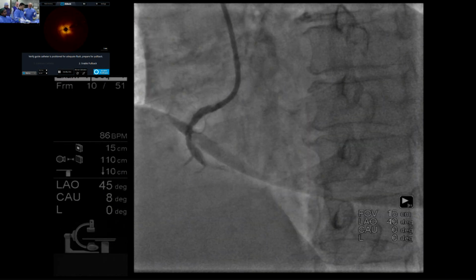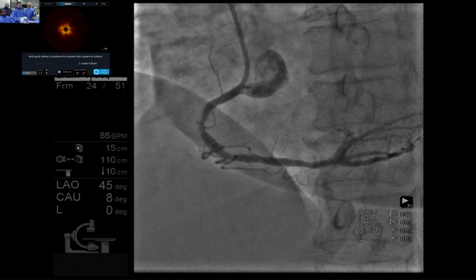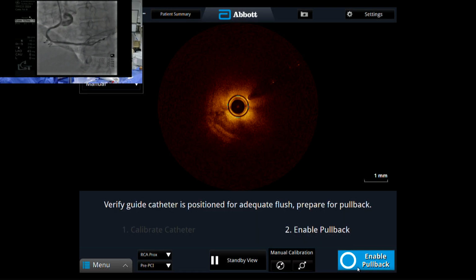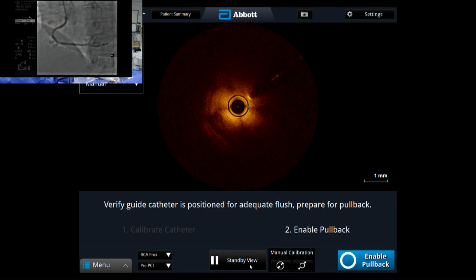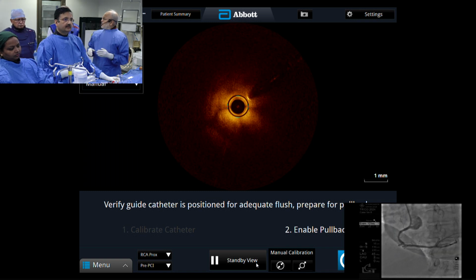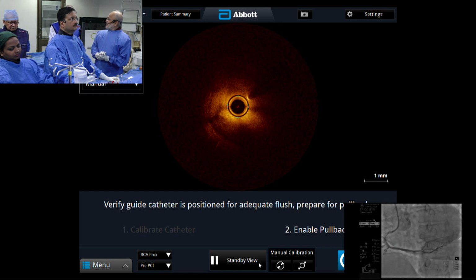There are some data available, I know that. But I don't know, what is the opinion from the, I may be completely wrong. But somehow this is a preconceived notion I have, and that is the reason drug-eluting balloon is still not there in my lab. What is your comment, Malcolm? Nothing yet, because I have no experience, because we don't have them available.